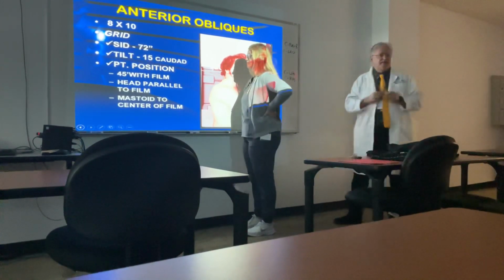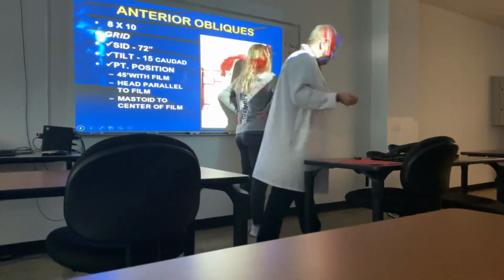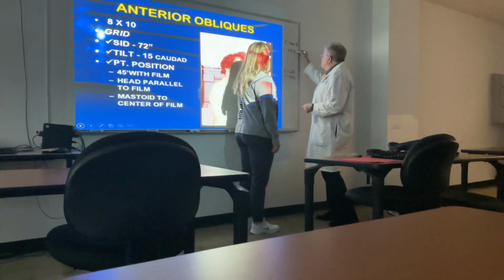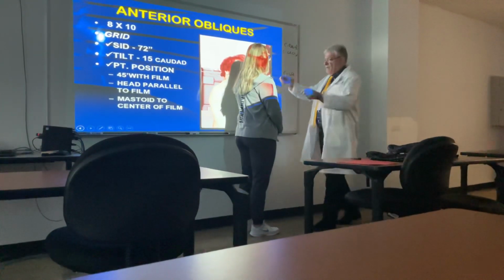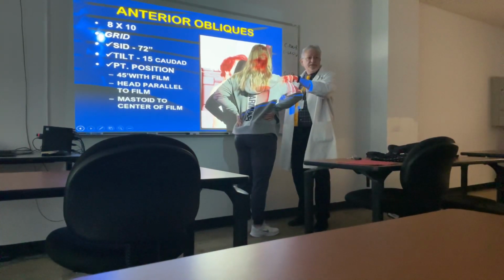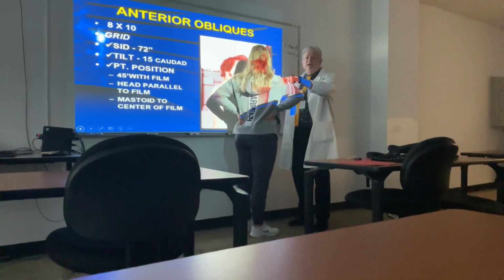That's factually correct. And if that's a true statement, what happens when I do this? Let's turn and do the opposite side. It's going to be the left side. So it's also factually correct. Now, every office does it differently. The advantage of this way is the anterior part is closest to the film. There should be less magnification. You don't even know what that is, but there's less of a magnification effect.